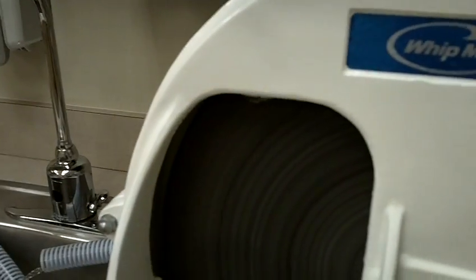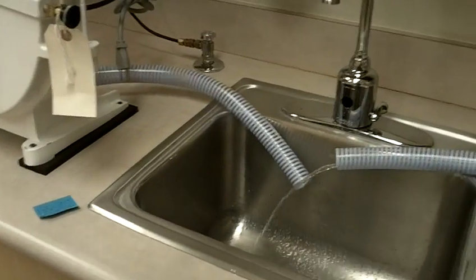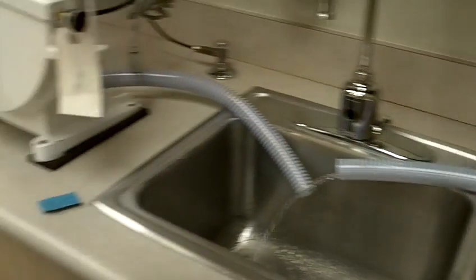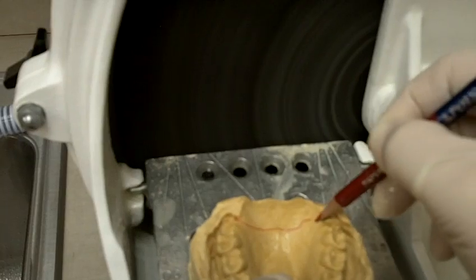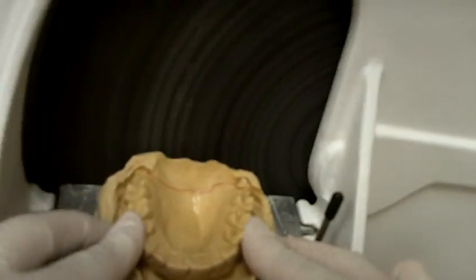So once you have that, you go back to your top model. And now you're going to work on the back. Something that your book tells you and you should have had done, and I'm going to show you just a demo, is that you're going to mark. Remember, 2 millimeters behind. So you should already have this marked. You're going to go in the deepest area, down in just like that. Okay, so this should already be marked when you come to trim. Technical difficulties there. Okay, and then you're going to push to the back.